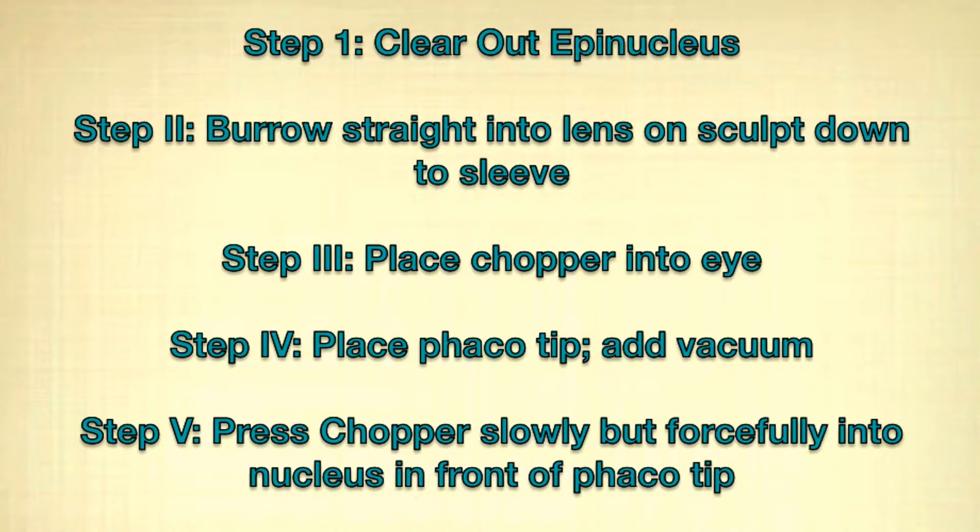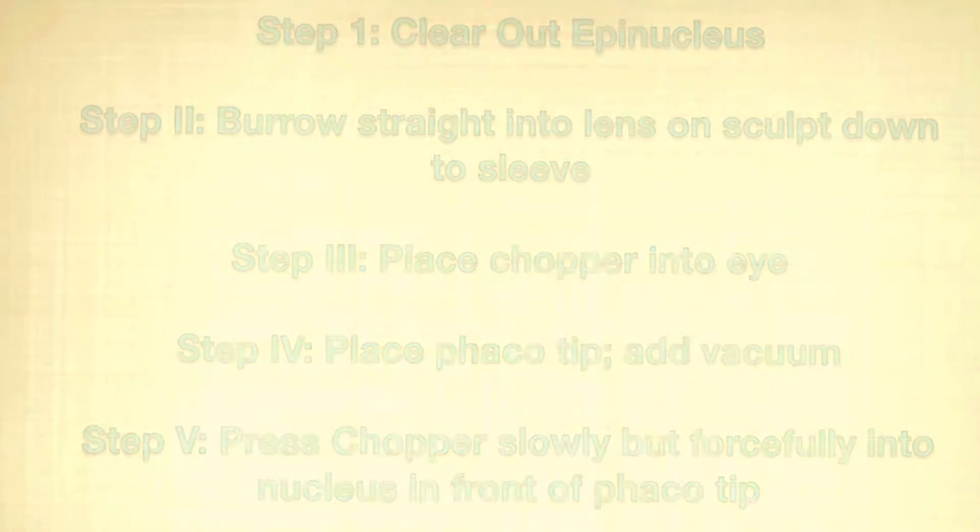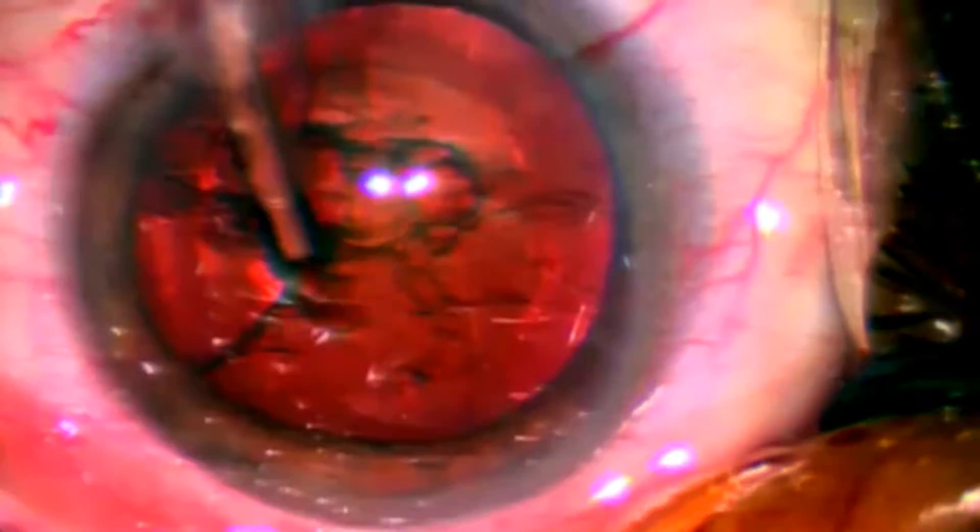Here I'll show five cases of vertical chopping followed by two cases showing how to proceed if the first chop fails. In this first case you'll see that I will initially clear out the anterior epinucleus so that we can see the nucleus, which is the part that we want to chop. Then I will use sculpt mode to burrow a little tunnel, and you'll see some lens milk showing the lens is about 2 plus NSC, and then the lens is now prepared.